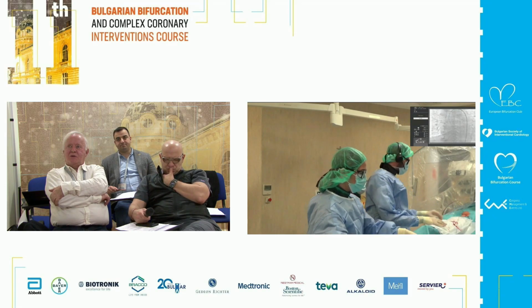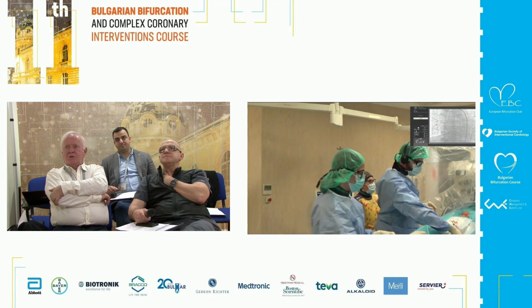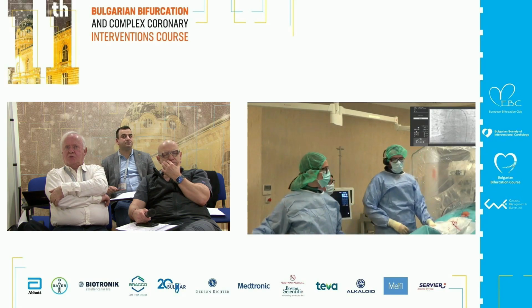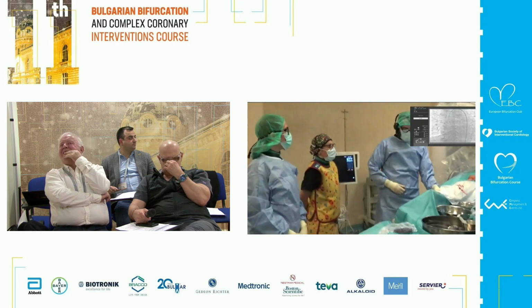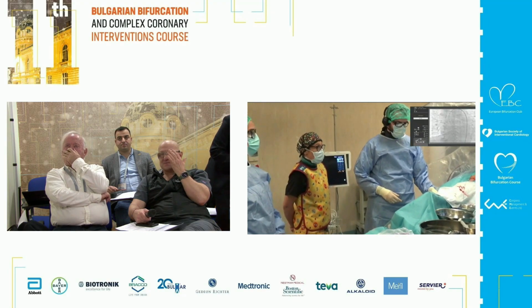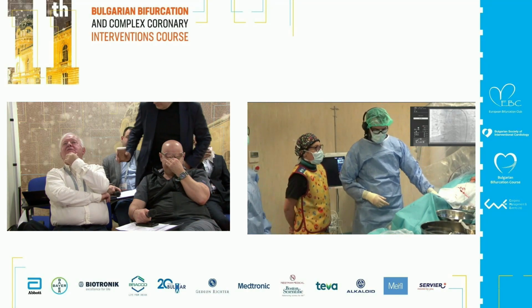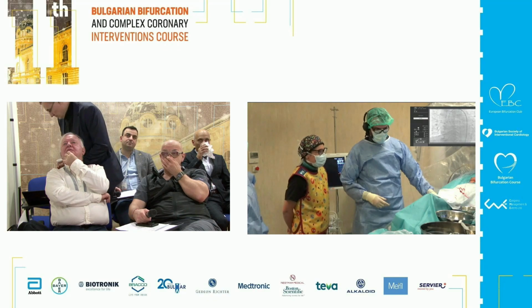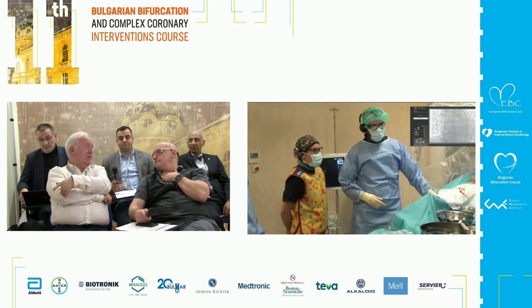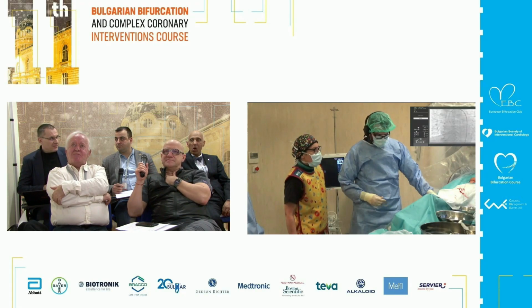You saw the case, and we've just done the diagnostic of the right coronary artery, and now we're discussing the guiding catheter for the left main cannulation. You saw the film, and what kind of guiding do you recommend to Dr. Chilingirov? No, this is for the panel. You're a part of the panel.